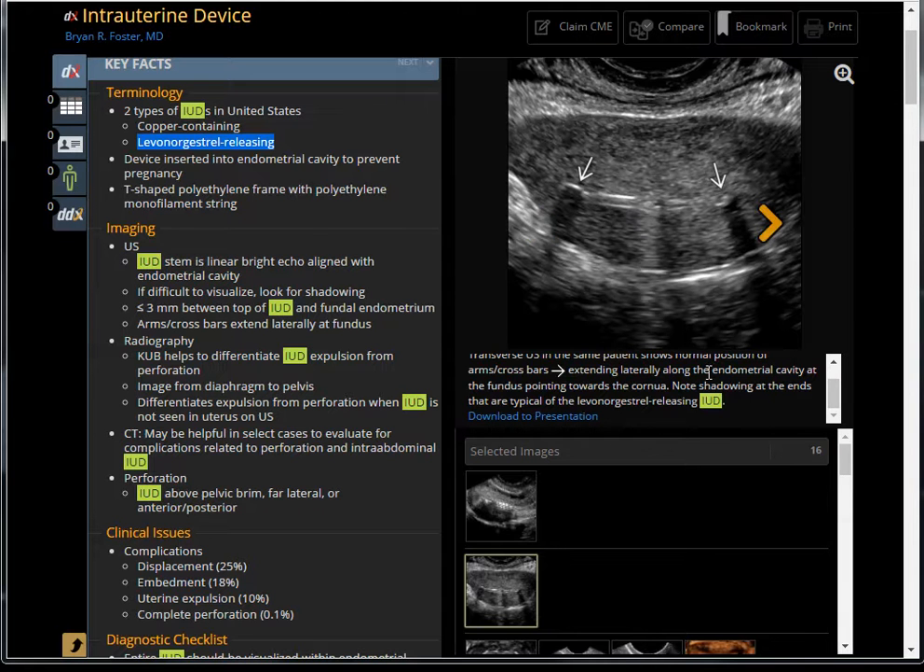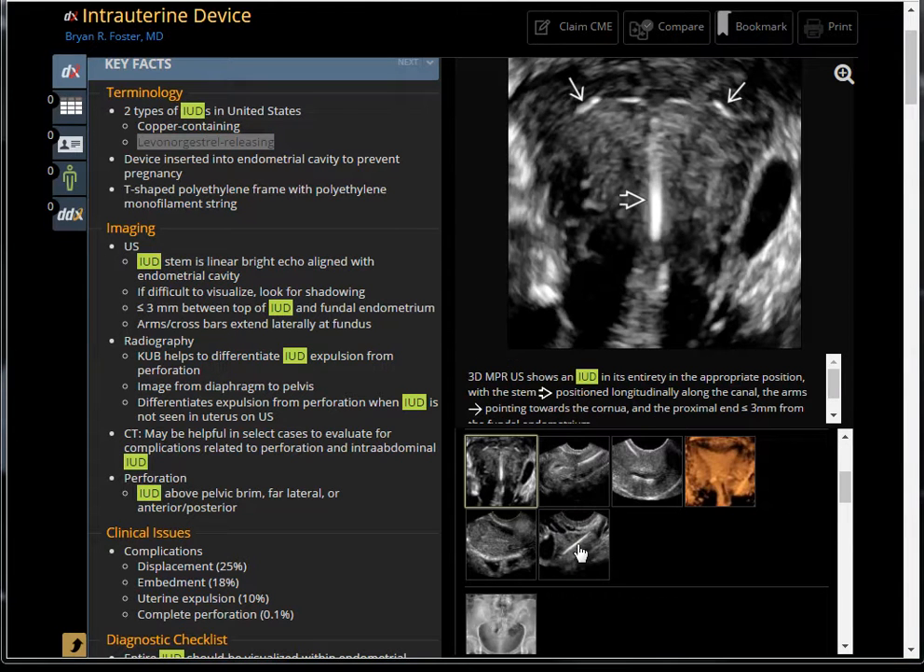We should still be able to see the Mirena device. The normal location should look like this — a T-shaped device with a stem. Here's the stem, here's the arm. The stem is positioned longitudinally along the endometrial canal and the arms point towards the cornual on each side.